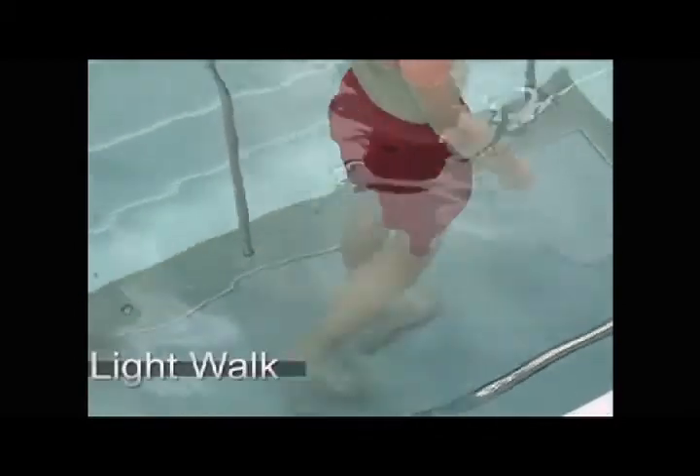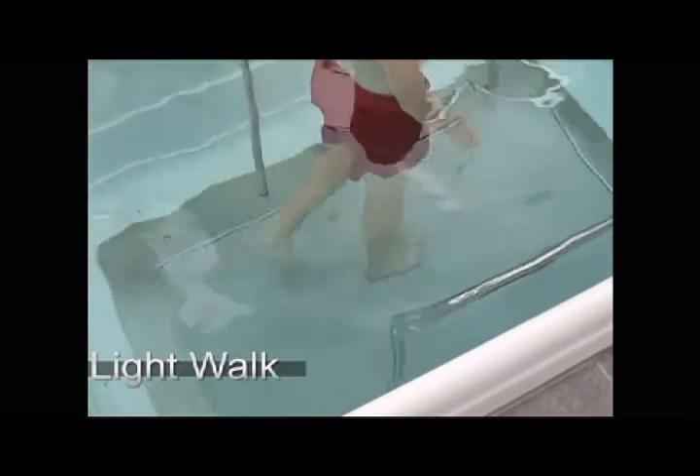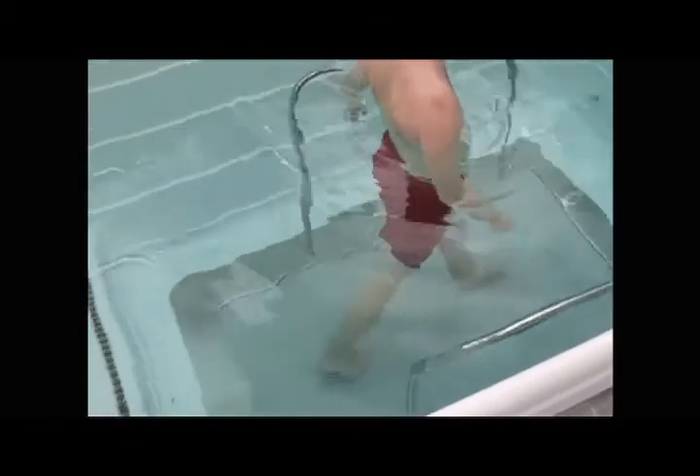We did that for about two minutes, then the next segment we did some walking. Started off at one mile an hour, very gently walking, working on his gait heel to toe. We kept making him watch the video, making sure he was touching down with his heel and rolling over to his toe. We did that for two minutes, then increased to two miles an hour for another two minutes, still emphasizing gait.